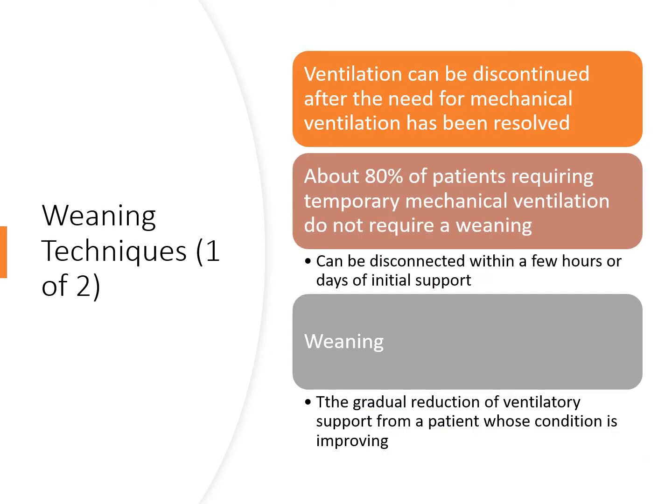All right, so let's start with weaning techniques. So patients require mechanical ventilation when their ability to support vent demands is outweighed by the disease process. So their respiratory drive is not keeping up with their disease process. It's inadequate. It can't maintain ventilation on its own because of the disease or because of medications that we give patients. So they usually go into ventilatory fatigue or ventilatory failure.